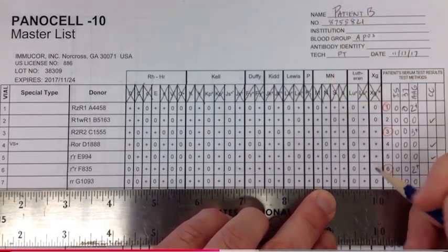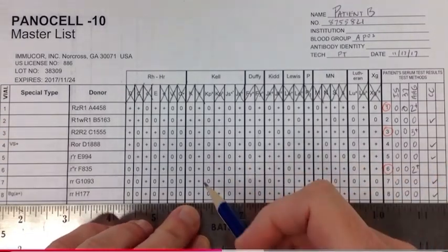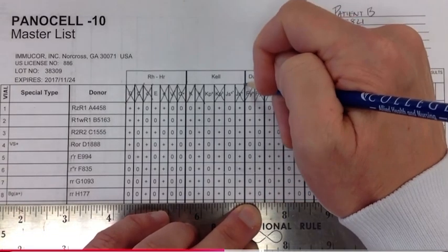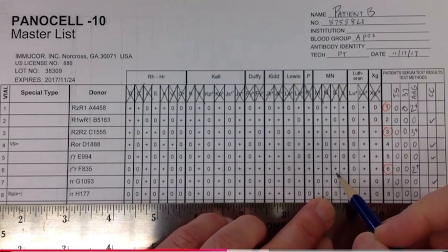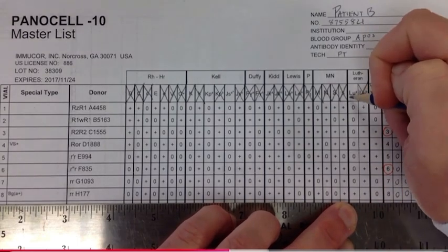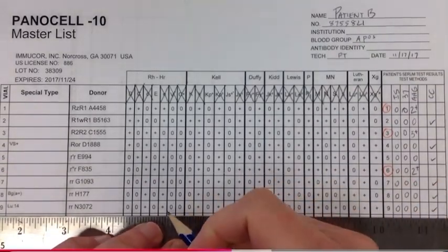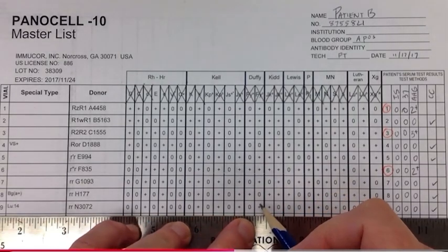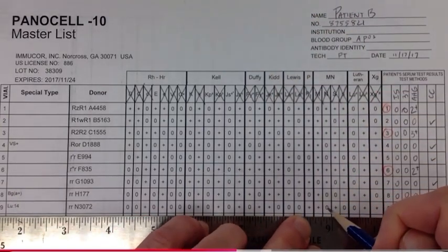Big N, homozygous. Okay, Duffy A, homozygous. Okay, Lutheran A is heterozygous, so we'll give that just a forward slash. Okay, Kid A is homozygous. Let's get rid of that.